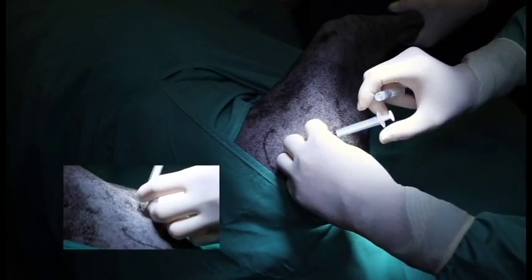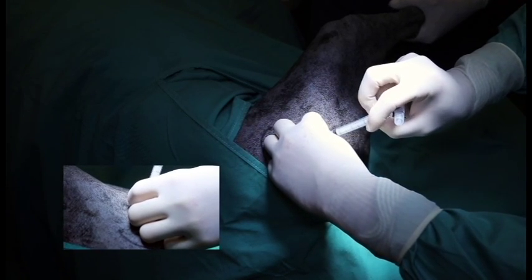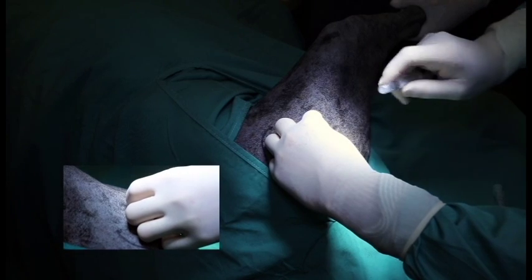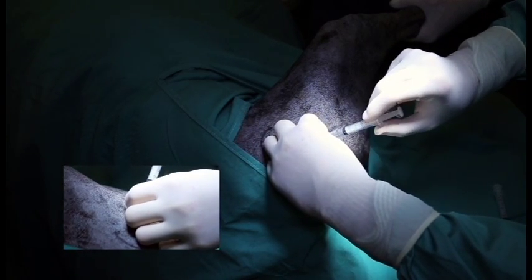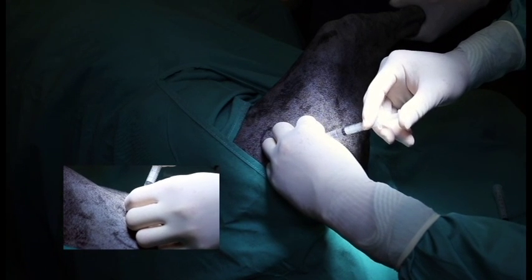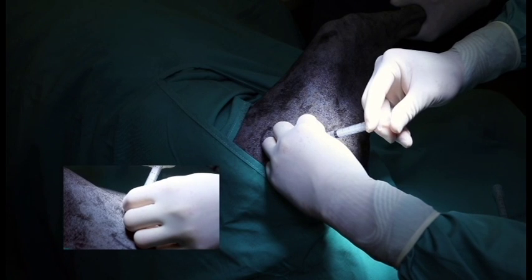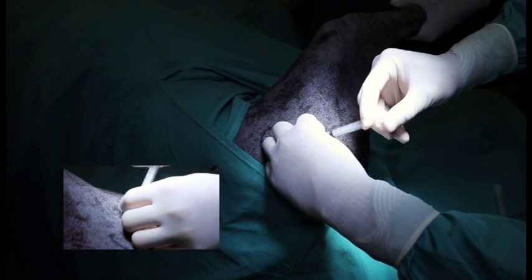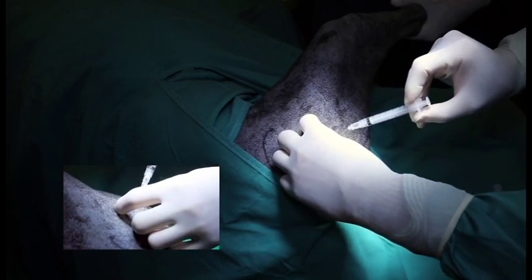To inject product into the hip joint with your pre-placed needle, remove the syringe and replace it with a loaded syringe with your product and slowly inject. Once you're done with injection, release pressure off the plunger and slowly remove your needle.